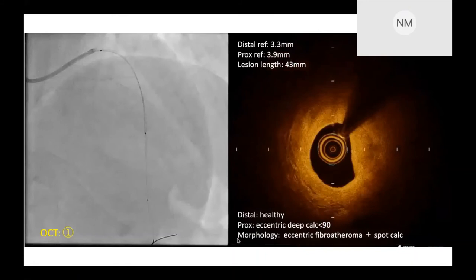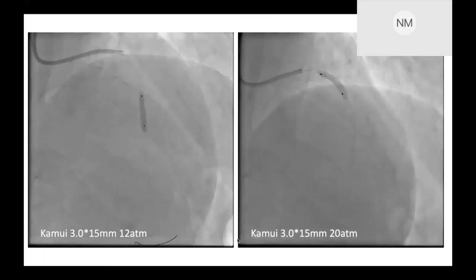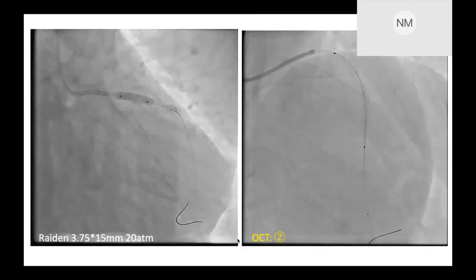Based on OCT findings, lesion length is 43 mm, distal reference diameter is 3.3 mm, and the proximal reference diameter is 3.9 mm. We then performed balloon dilatation with a 3.9 mm balloon at high pressure. Then we deployed a stent 3.0 by 28 mm, and secondly I placed a 3.5 by 18 mm stent at 16 atmospheres. Finally, based on the first OCT examination, I performed post-dilatation using a 3.75 by 15 mm balloon at 20 atmospheres.